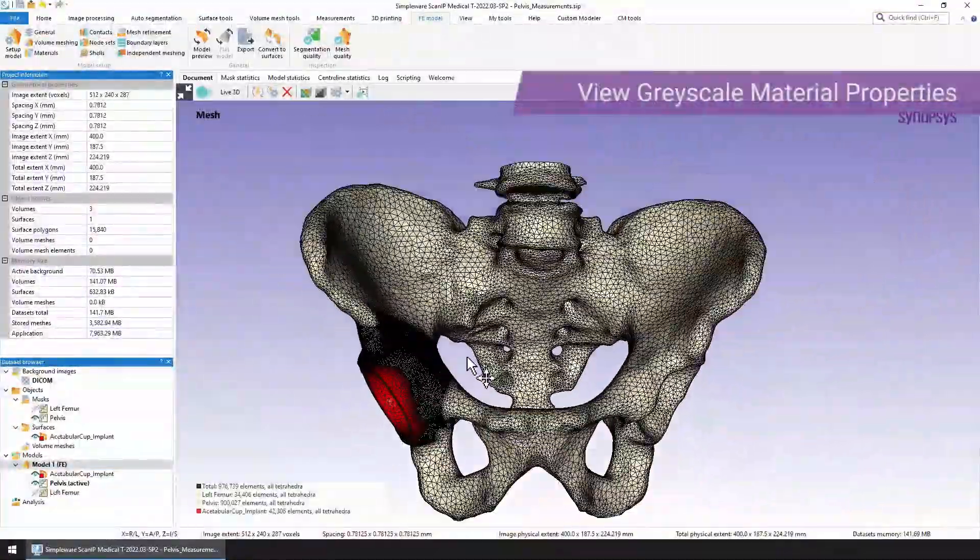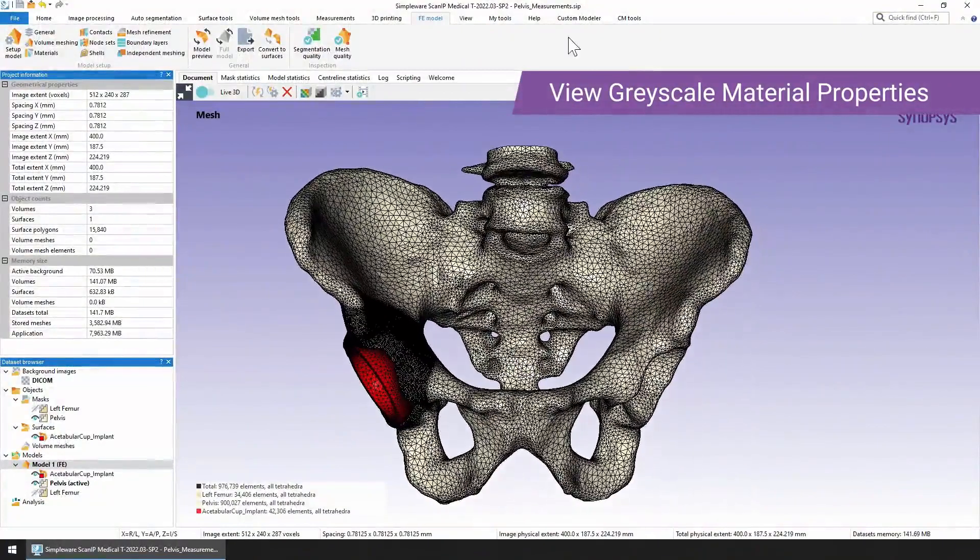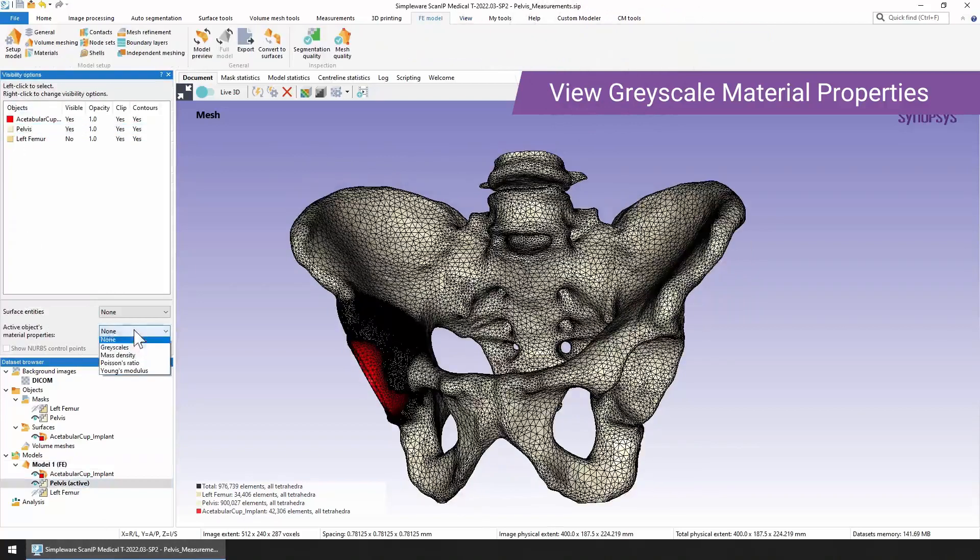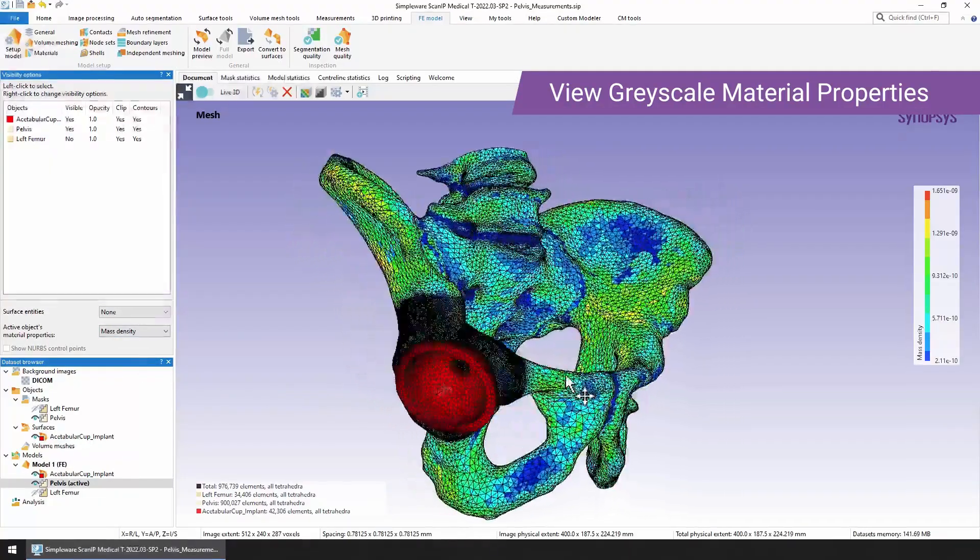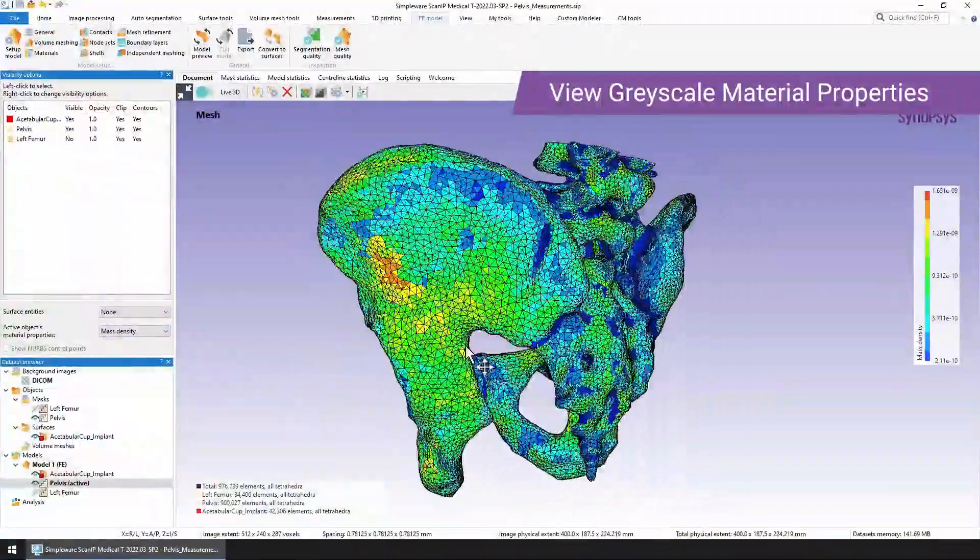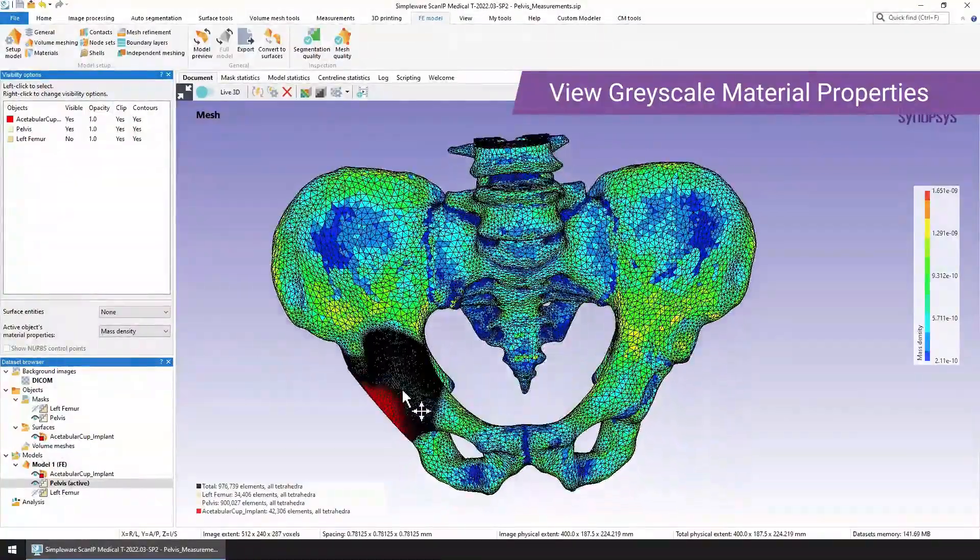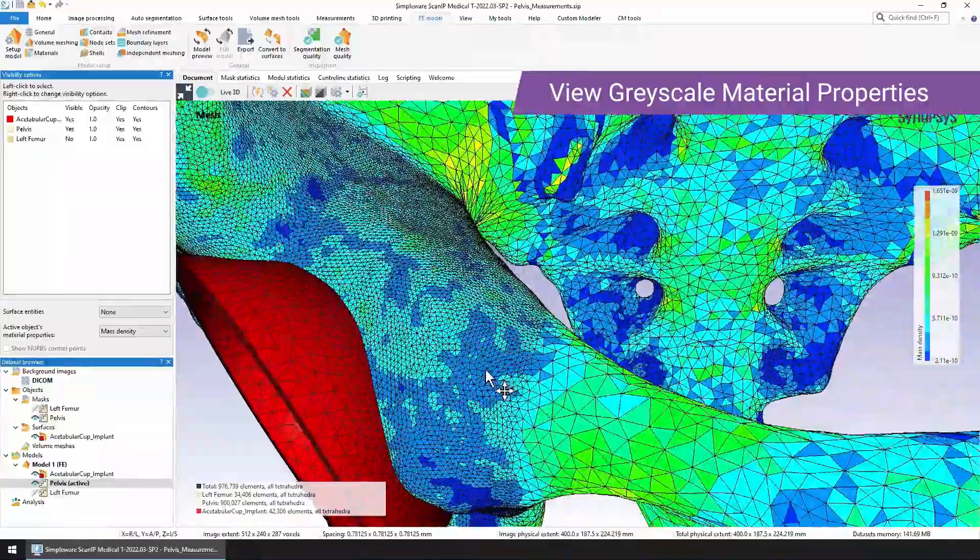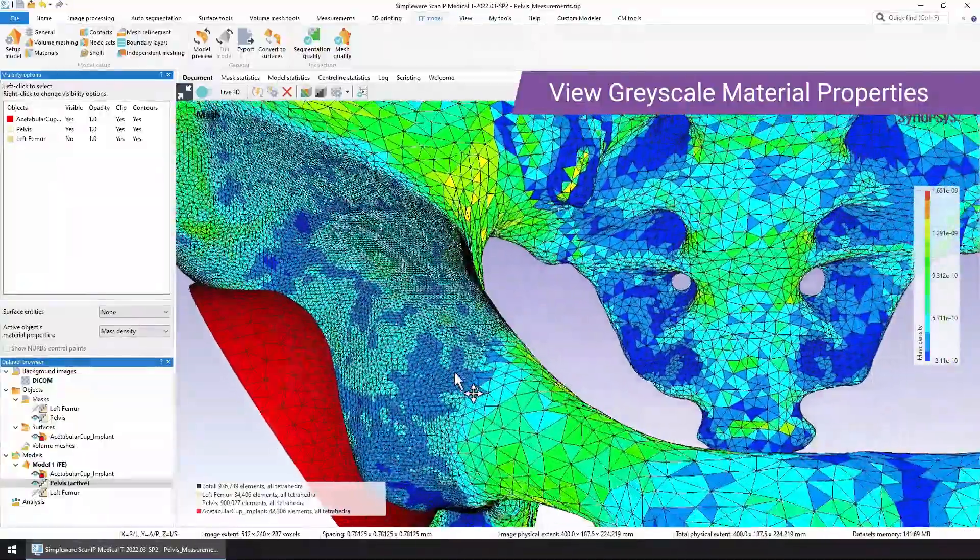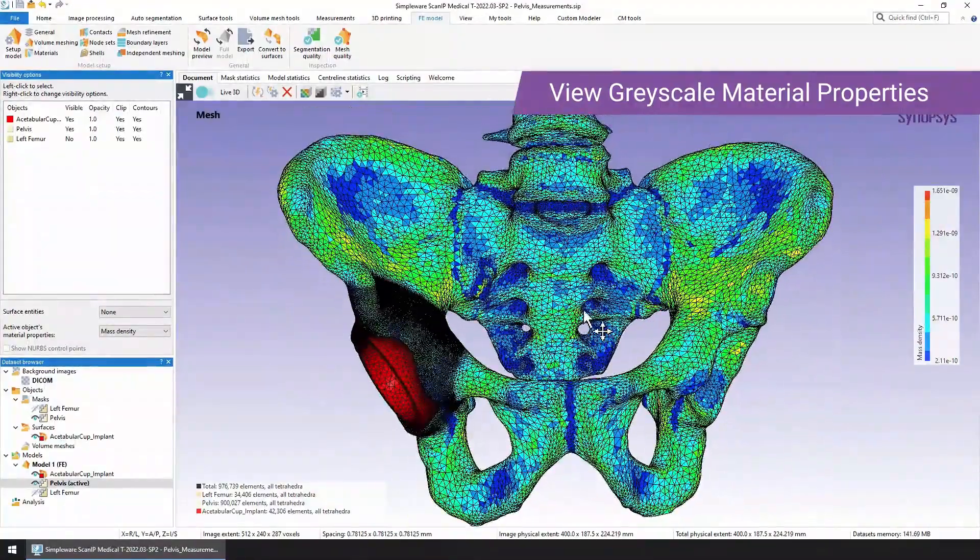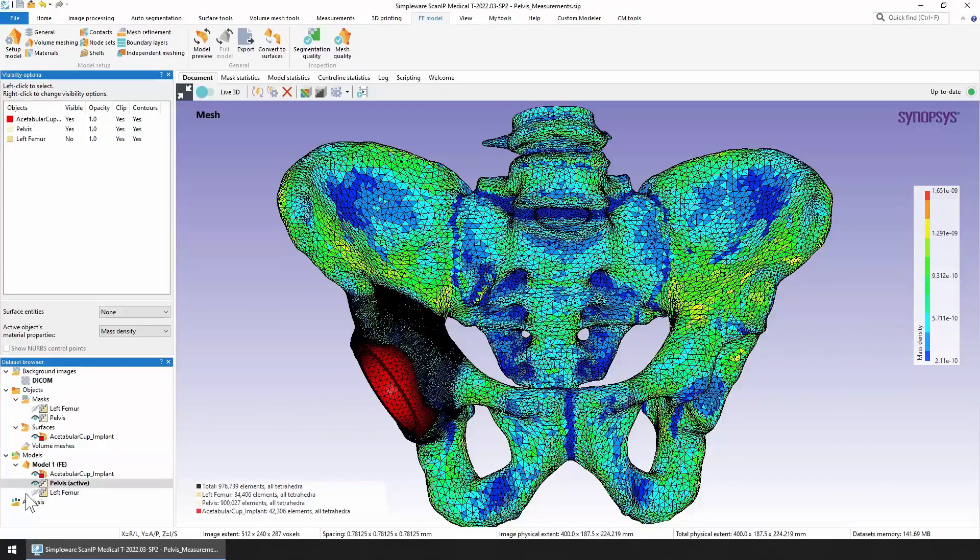The other thing I wanted to show you was the grayscale material properties. To view those, you go into view, visibility options. Make sure that the pelvis is active because this is the one that I've set up the material properties on. Then we just select mass density. Here you can see a range of values for the mass density for the pelvis part. You can see that these are assigned to each of the elements within this range. In this case, I chose 10 steps and you can see the mass density listed on the right hand side here.